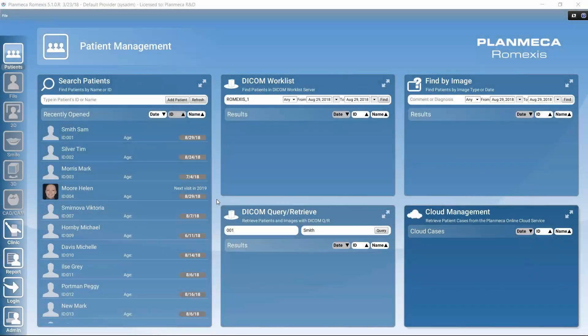In this tutorial we will take a look at Print Editor in PlanMeka Romexis software. Print Editor is a tool with which we can make custom printouts with the patient's images. We can also determine our own layouts for the printouts, so we can always make printouts with specific layouts defining how the images are organized. Let's start by seeing how we can add images to printouts.